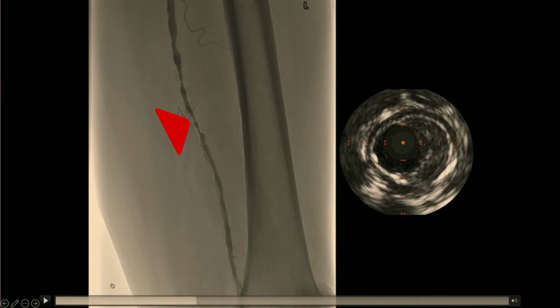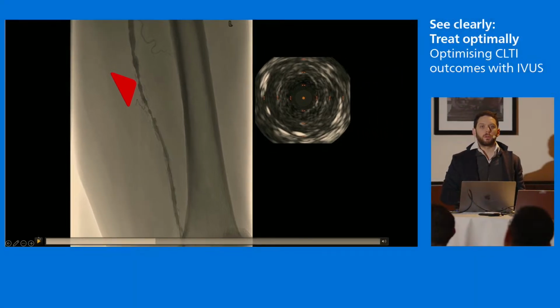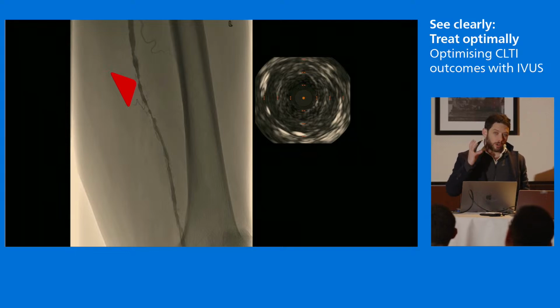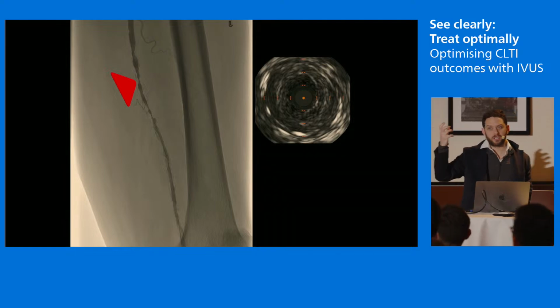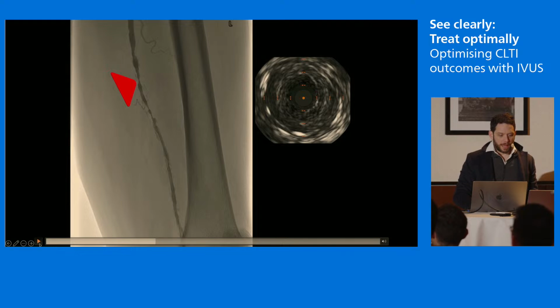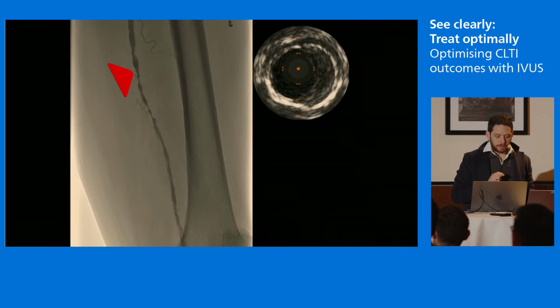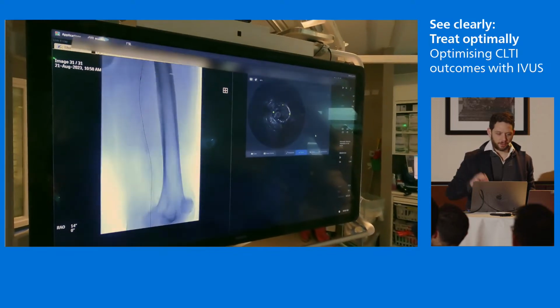As we go further up that vessel, the next station, and this is all in the background of calcification in the media. This lesion here, importantly, what does that show? Mike? Exactly, thrombus or chronic thrombus or fibroelastic plaque, which has occluded the lumen. It's really hard to tell, and this is one of our first IVUS cases. More positive remodeling. And then suddenly it looks like a stent, doesn't it? That's medial calcification.